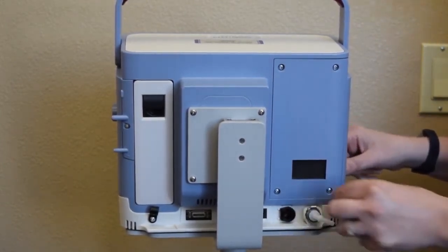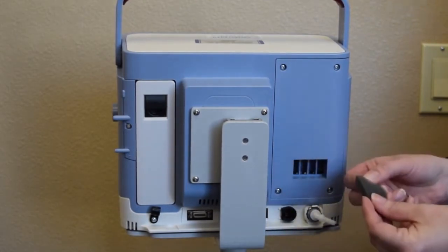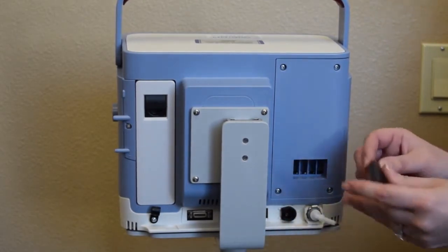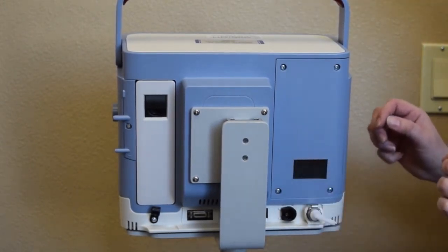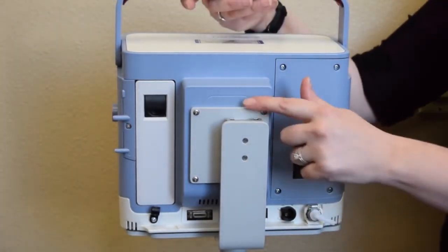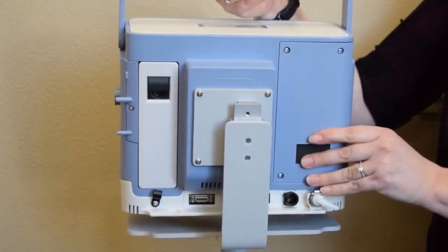The air inlet filter gets cleaned out weekly, just mild soap and water. Rinse it well and let it air dry before you put it back in. The ventilator can be removed from the vent stand by sliding up on the bracket and then can easily be placed on the back of a wheelchair.